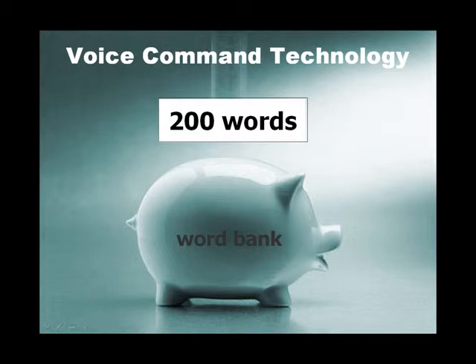PerioPal was designed for voice input. Other voice-activated periodontal recording systems were designed for mouse and keyboard input, then modified to support voice activation. Every facet of PerioPal is designed to facilitate accurate and rapid data capture during the recording of a periodontal examination.